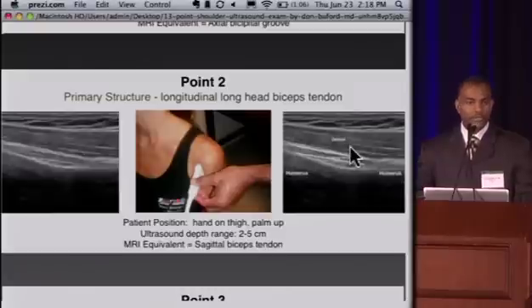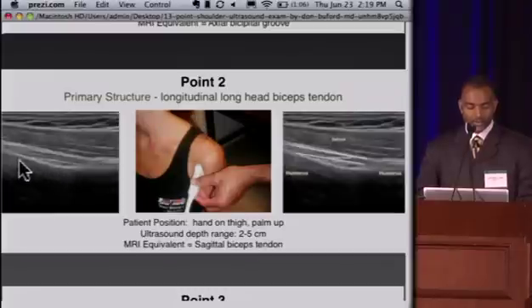At point two, we look at the same structure — the long head of the biceps tendon — in its longitudinal orientation. The anterior humeral cortical margin is visible, and the next structure anterior to that is the long head of the biceps tendon, seen as parallel fibers running across. The transducer has been rotated 90 degrees along the anterior shoulder, giving us this image of the long head of the biceps tendon running along the anterior humeral cortex.